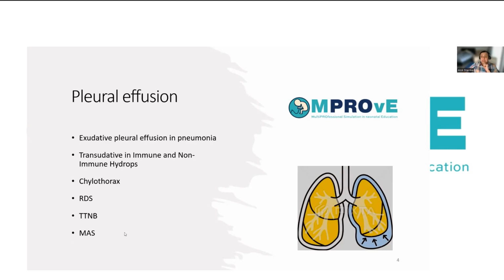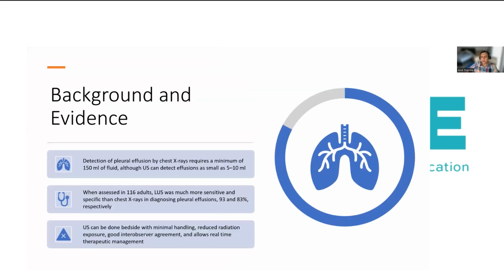What is quite interesting is that the diagnosis of meconium aspiration, when you see it on the X-ray, actually rarely presents with pleural effusions. But it's quite interesting how many times I've actually picked it up while I've been doing lung ultrasound in practice.